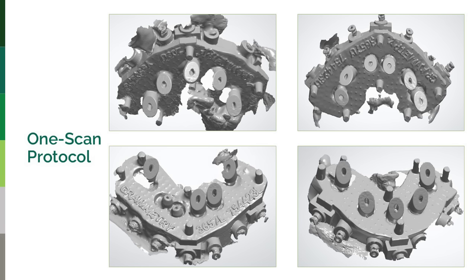So he does one scan with an IOS, but then he does a quick Micron Mapper scan for the dialing in of the accuracy of the implants. But the nice thing about our service is that we can recognize the shapes of the Micron Mapper as healing collar scan bodies with the intraoral scanner, just as you would, not to the same degree of accuracy, but just as you will with the Micron Mapper for photogrammetry.